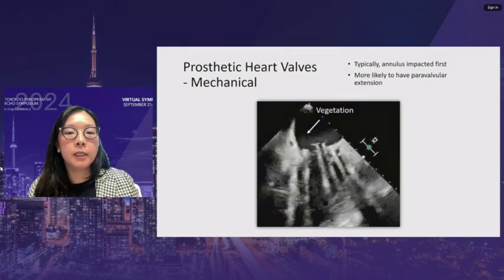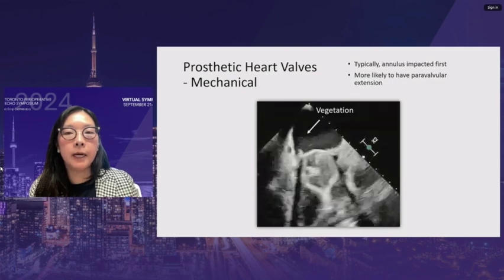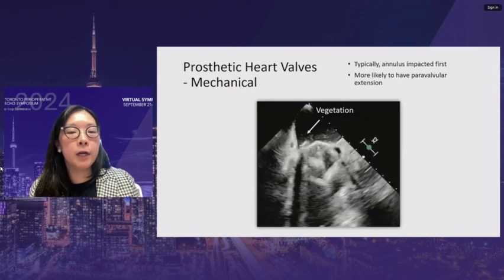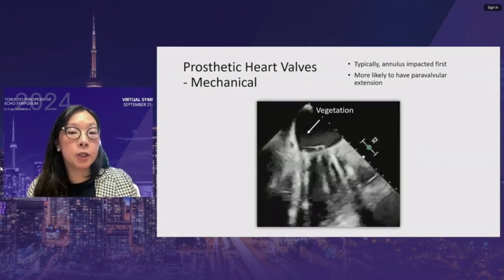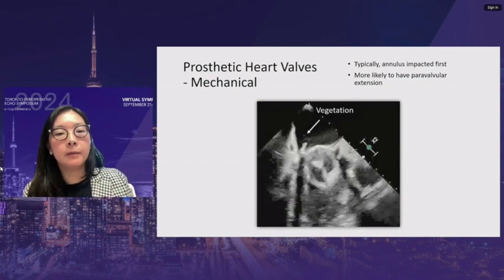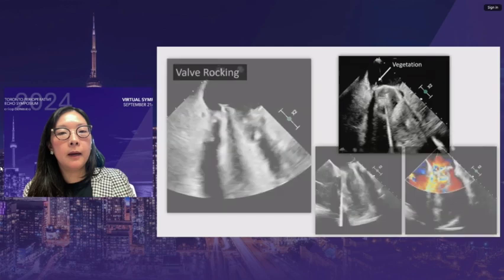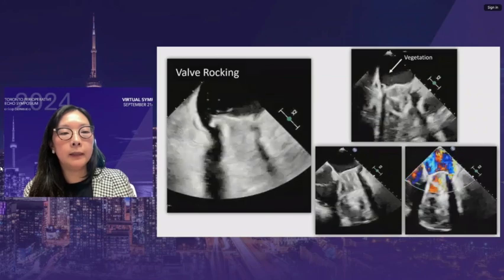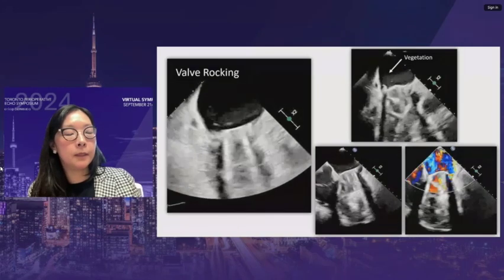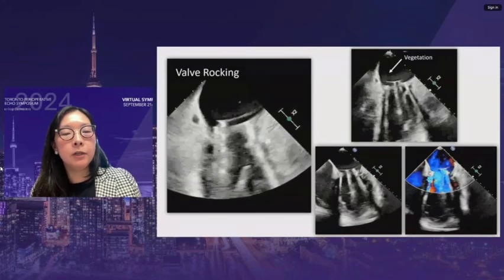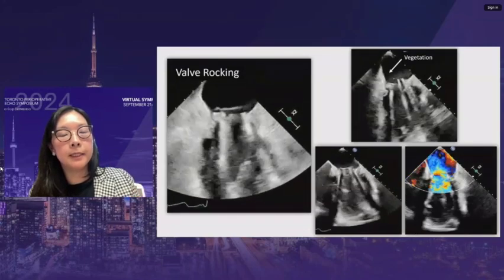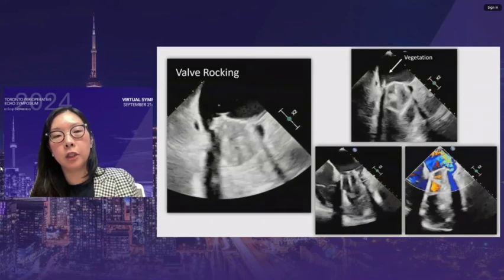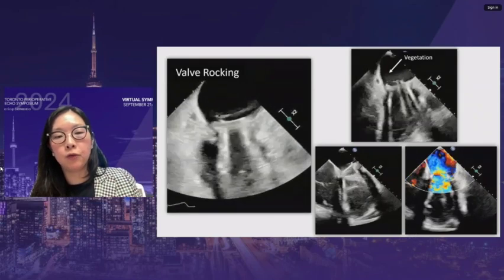For mechanical prosthetic heart valves, the discs are usually not involved; the annulus is impacted first and prosthetic paravalvular extension is more likely. Aortic paravalvular extension is actually more common than mitral. A case demonstrates dehiscence of the valve and rocking — an actual lack of connection to the annulus. Care must be taken not to confuse instability with rocking; a reconstructed pericardial annulus can appear to rock when it is not a true disconnection.